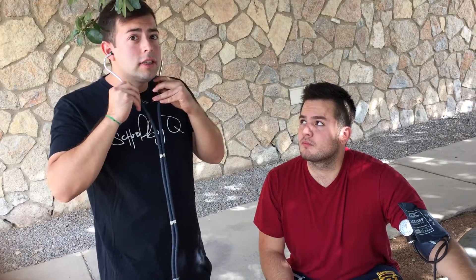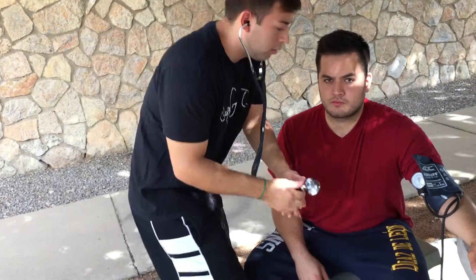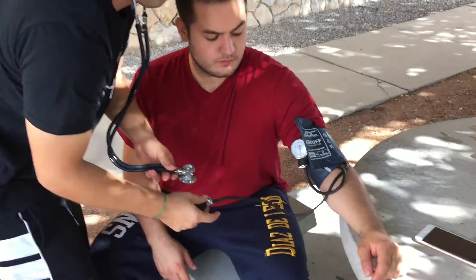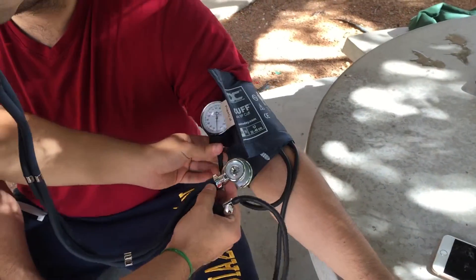I'm going to go ahead and insert these in my ears, pointing outward. When taking the blood pressure reading, you want to go ahead and inflate your cuff to about 180 millimeters of mercury. I'm going to go ahead and start to inflate it and take the blood pressure.